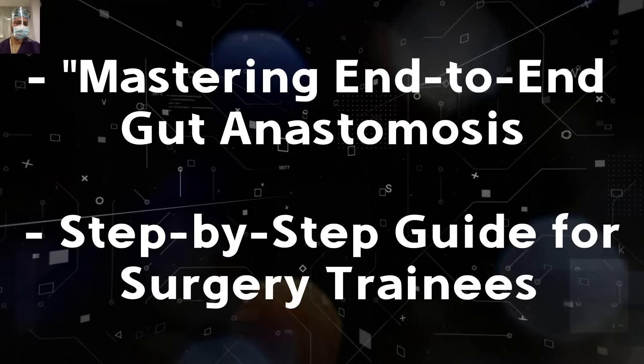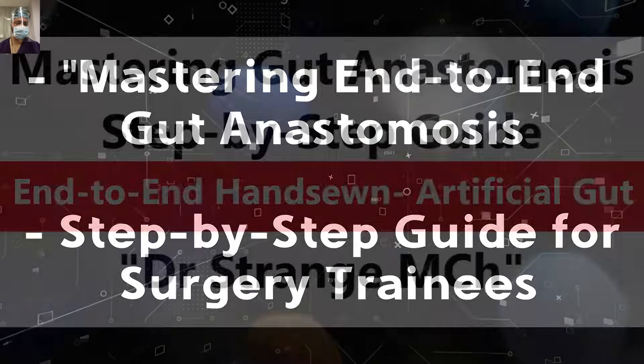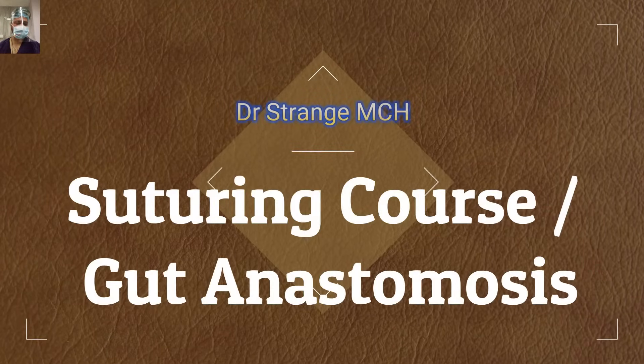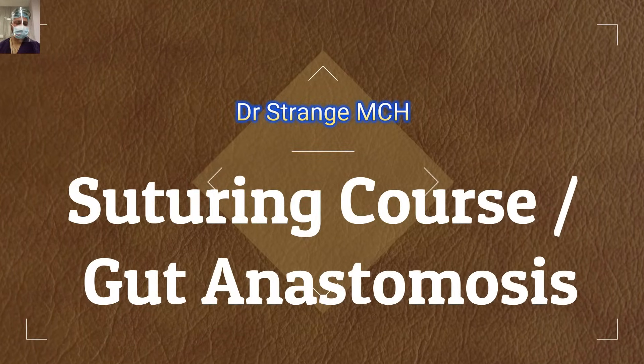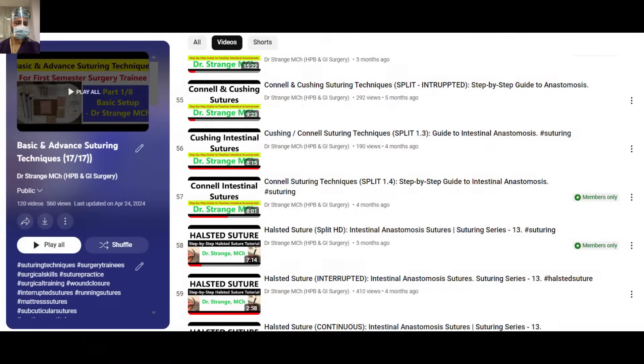Hello everyone. In today's video we will demonstrate the hand-sewn end-to-end gut anastomosis on artificial gut, and it will be a step-by-step guide for all the surgeons. This was a very long pending demand from my viewers on YouTube and on our app. This video will be available under two course heads: gut anastomosis and the suturing course, so you can view it in either of them.